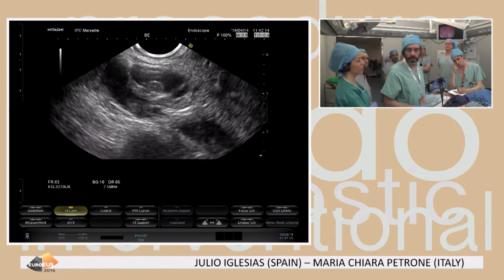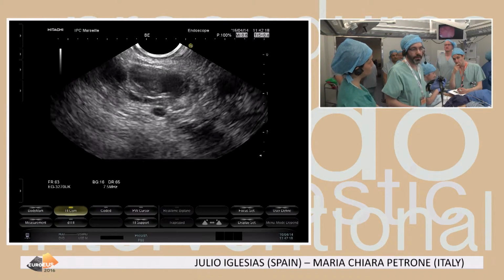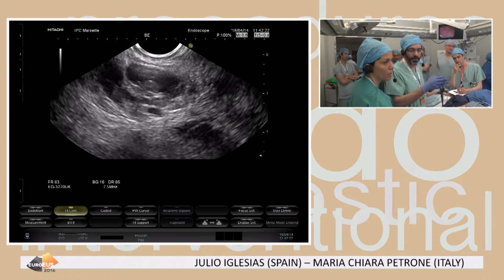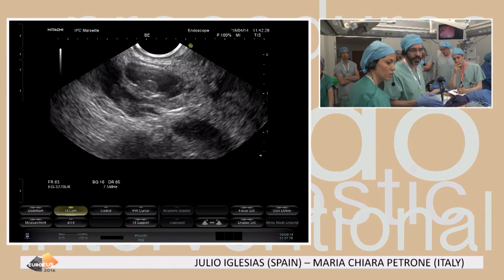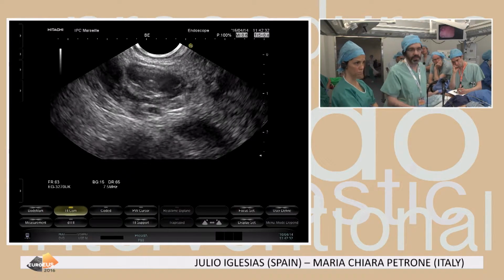But if there is any enhancement at Sonoview, for sure the patient will go for surgery? In my hospital, even over 5 millimeters with enhancement, in a patient below 60 years of age, we will discuss proposing surgery.